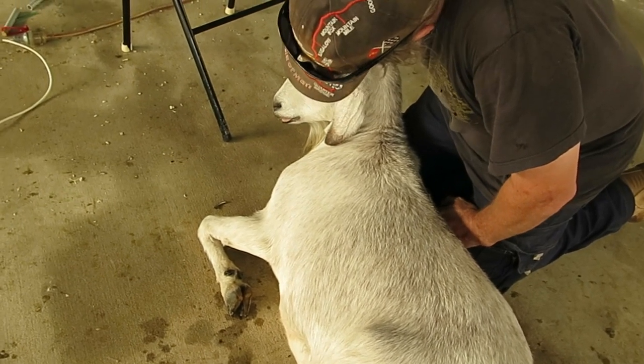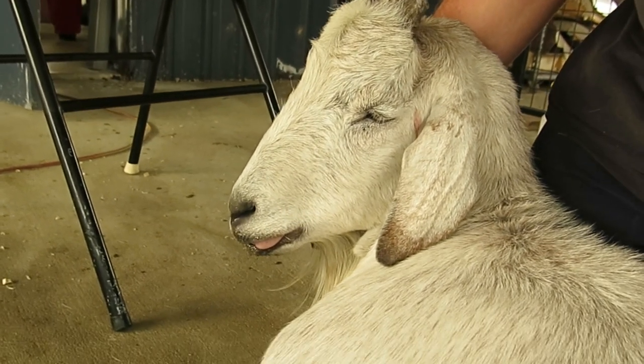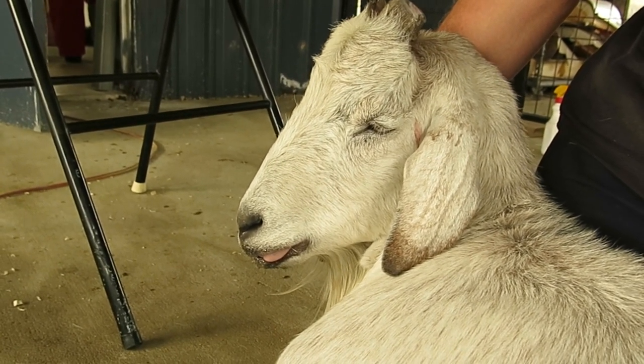As you can see, the goat is still asleep. It's dribbling, tongue is out, and eyes are semi-closed.